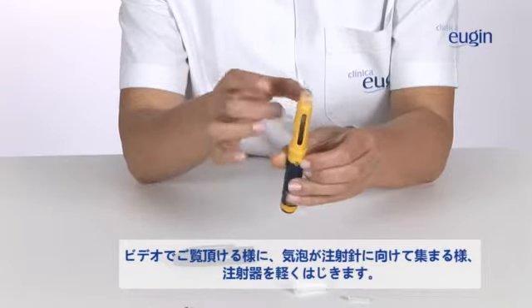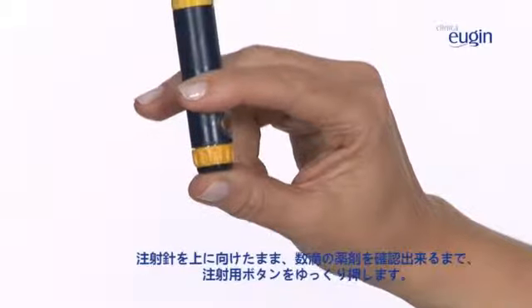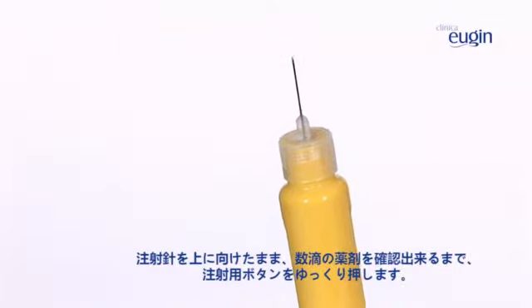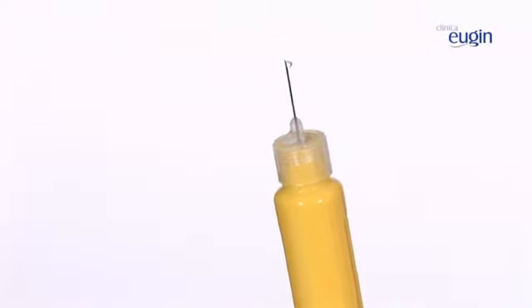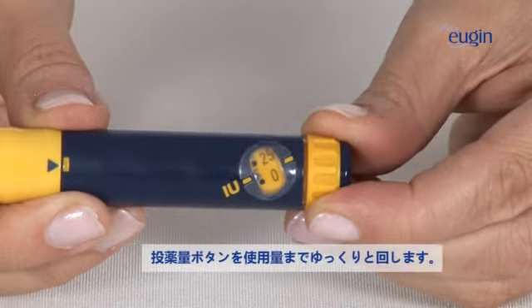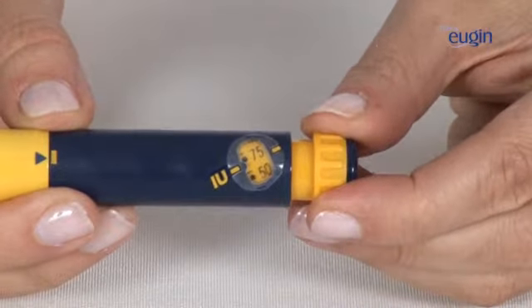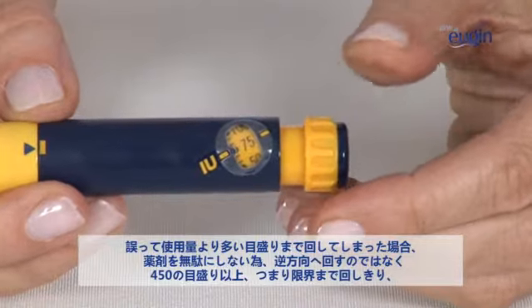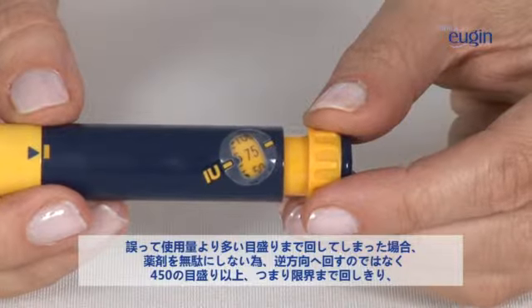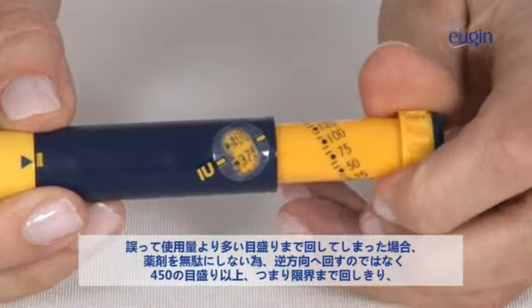Tap the pen lightly with your fingers, as shown in the image, to make the bubbles rise to the needle. Hold the needle upright. Now, press the injection button until some droplets appear at the needle tip. Now, set the dosage that your doctor has prescribed. Turn the dosage button smoothly until you have the exact dose. If you turn the dial too much, don't try to go back as you may lose the medication. Keep on turning the button until you go beyond 450, the maximum dialing point.